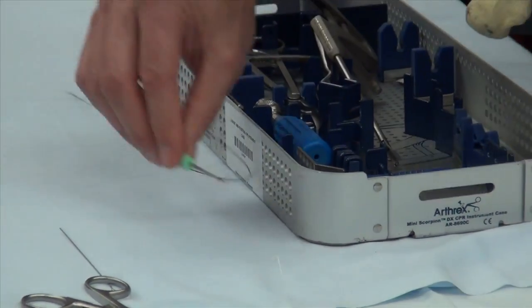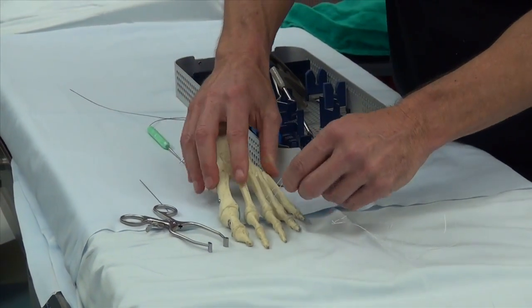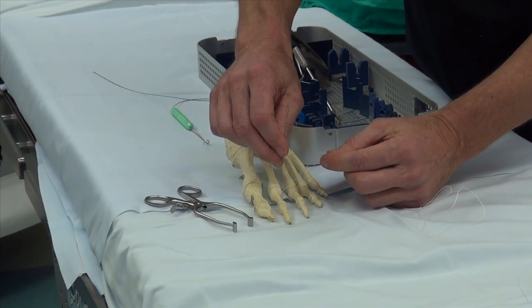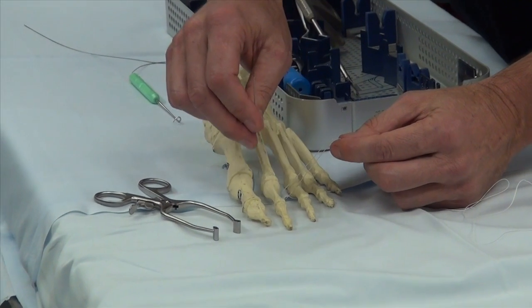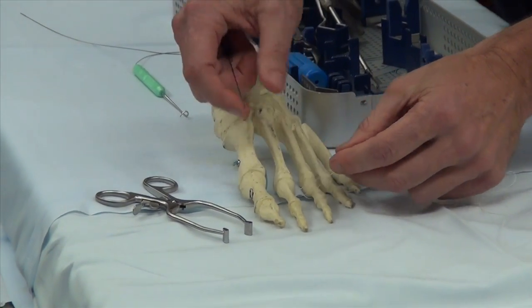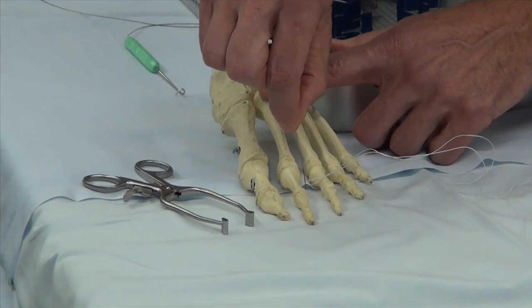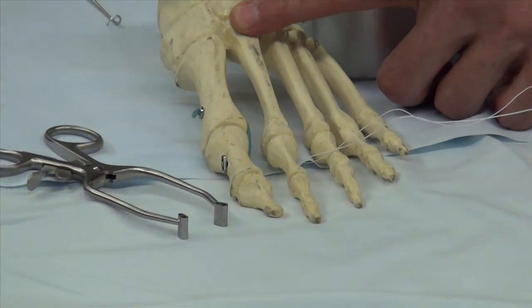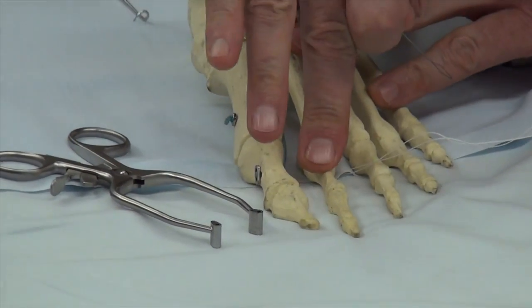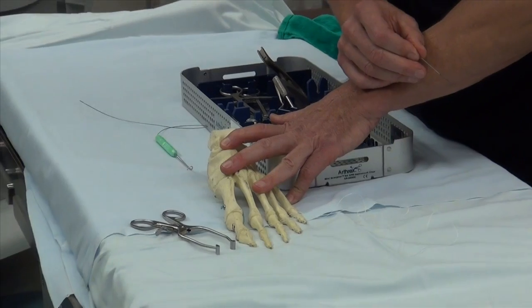With the Scorpion or the pigtail, once the suture is in place through the plantar plate, we drill two holes in the proximal phalanx — one on each side. Once the sutures come out, we tie the toe down by passing the needle passer through the bone and fishing the suture up and out through the top. With sutures coming out the top on both sides, we simply tie it down and the toe comes down in a natural format and stays down — and of course the plantar plate is repaired.